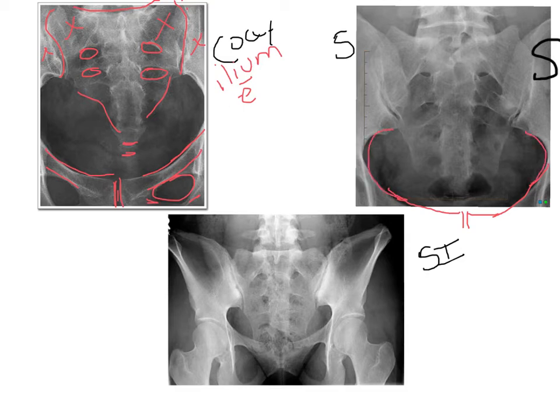And notice the shape of the pelvic brim in comparison to the coccyx. It is more squatty and flattened. You could say it has an appearance of being foreshortened. And actually it is being foreshortened because we angle cephalically. So it foreshortens that pelvic brim area and then forces the convex curvature of the sacrum, that shovel shape, to become more flattened out so that we can see all of the sacral foramina in their entirety.